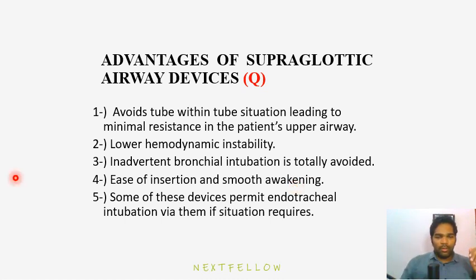Now coming on to ease of insertion and smooth awakening. Anyone can insert it. You saw the procedure, it is very simple. And some of the devices permit endotracheal intubation through the laryngeal mask. We will see that in the next presentation. Some LMAs can be used for intubation also.